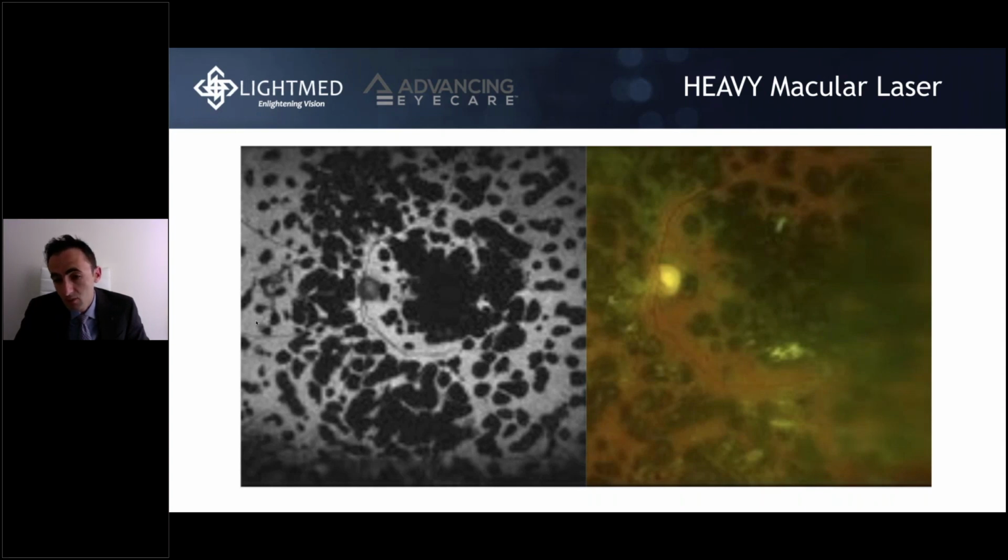and just apply it around the break, because sometimes it's very hard to get anterior to the break, to the very periphery. If the retinal break is way in the periphery, you're not going to be able to center your circle perfectly. So I usually go with the pattern of 4x4 or 3x3 and make my way around the break and try to close on the break on the anterior edge. If you're not able to reach that very anterior edge of the break, then you can just create a triangle with laser scars to keep that break basically barricaded from the rest of the retina.